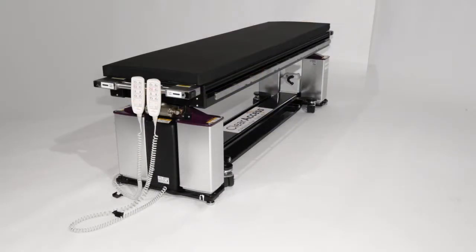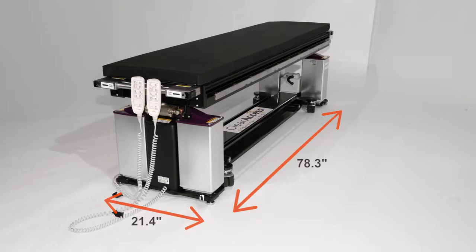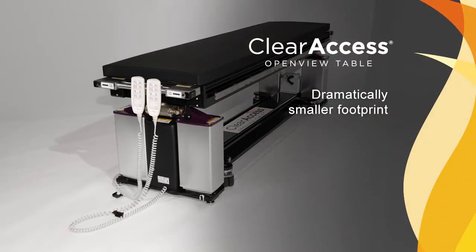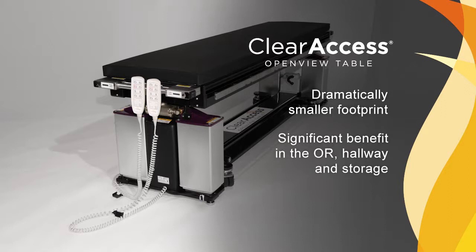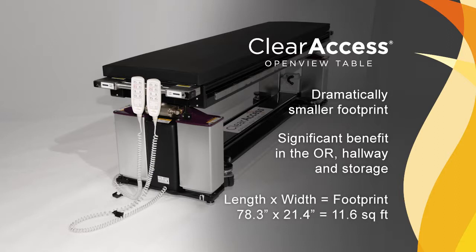Notice that without outboard wheels and towers, the ClearAccess table has a dramatically smaller footprint than the competitive systems. A small footprint has been shown to be a significant benefit in the increasingly crowded ORs, hallways, and storage areas of most facilities. Specifically, Jackson-style tables commonly occupy more than 26 square feet of space, while the ClearAccess footprint is less than 12 square feet.